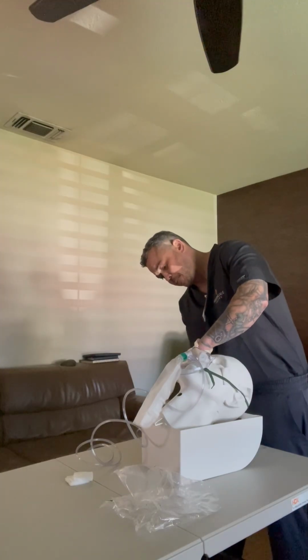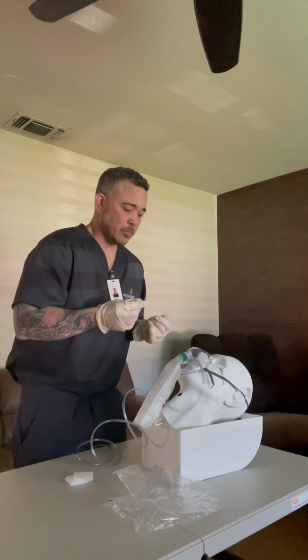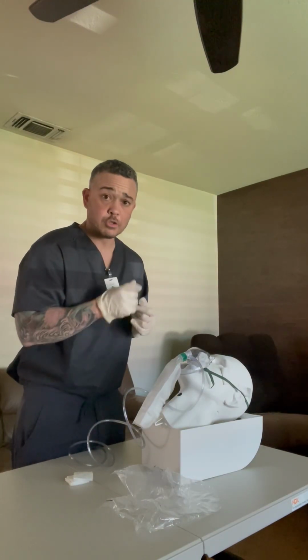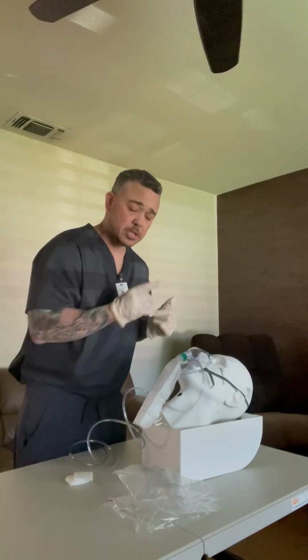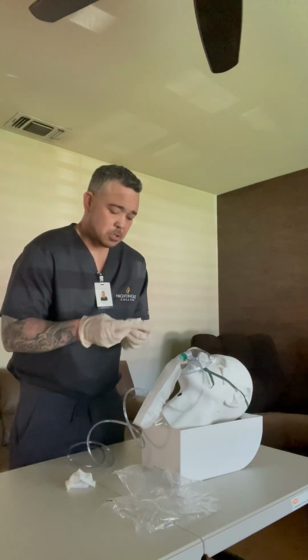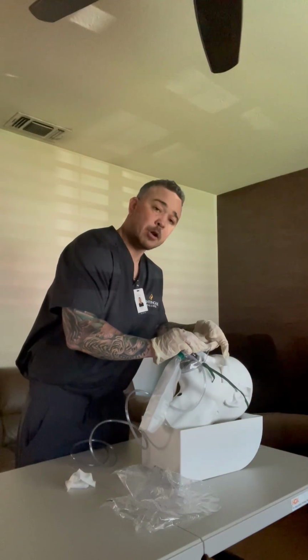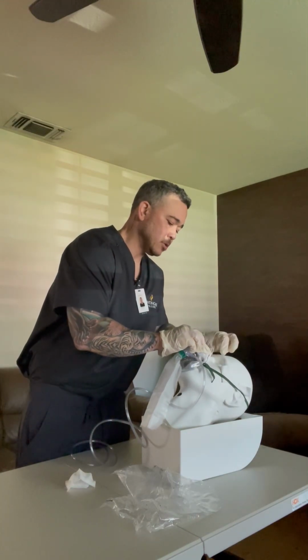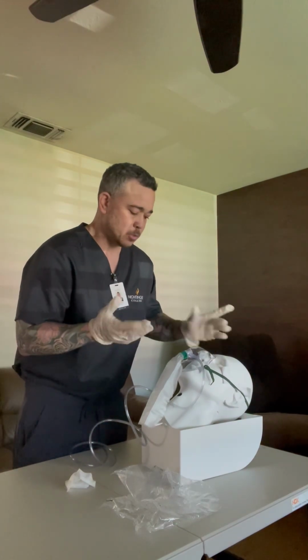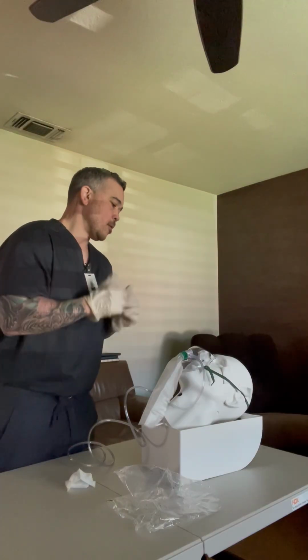Okay, also, if the patient is complaining of the metal piece irritating their nose, or if you notice any skin irritation or redness around the nose, you could do the same with the gauze. Just go ahead and lift up the mask, put it underneath the metal portion, and apply it to the nose. Go ahead and clamp that down, and that should be able to help as well. Okay, Mr. Smith, is everything okay? You feeling all right? Perfect.